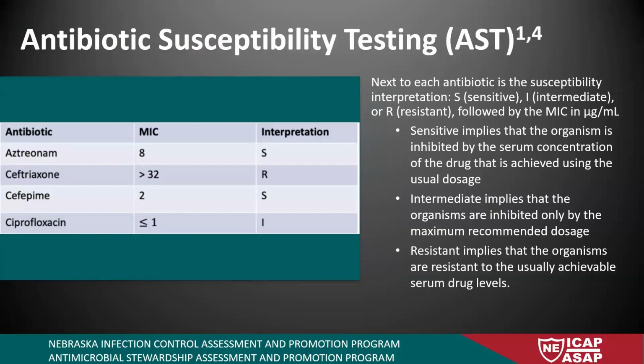There's many different methods to do antibiotic susceptibility testing in the lab. There's manual methods. The ones that are more common would be your automated methods. I know a lot of facilities use what's called a Vitek 2 machine. There's a Phoenix, a MicroScan. Several different companies do different types, but if you've heard those terms, those are the different types of machines that do susceptibility testing. And they can also identify different resistance genes with these different machines that they use.